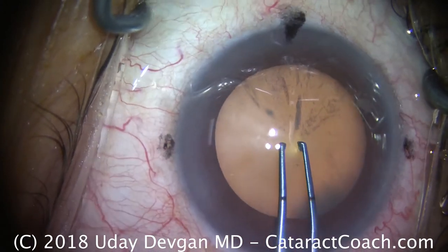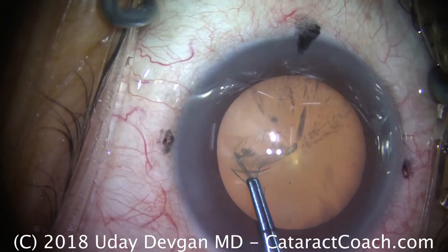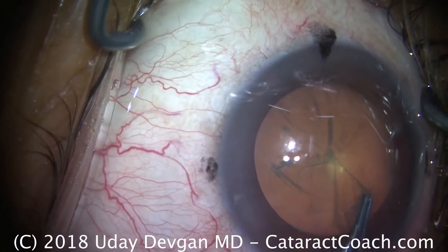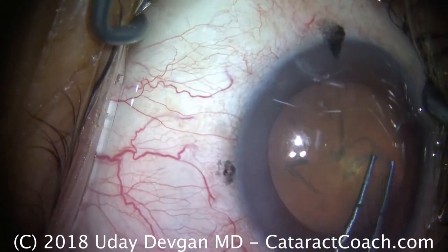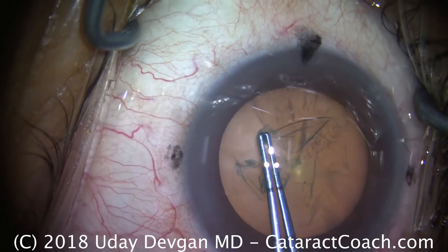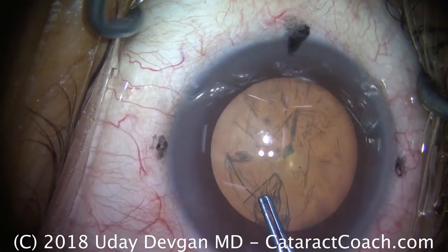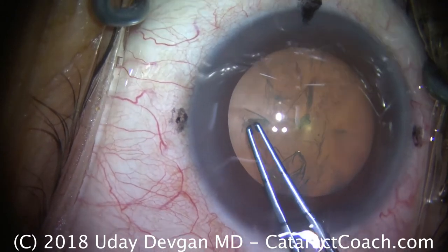Forceps are going in the eye to make our capsulorrhexis. We're creating a nice, round, continuous capsulorrhexis in the anterior lens capsule. We want to make it sufficiently large — aim for about a 5.5mm capsulorrhexis. Keep in mind that it will shrink-wrap down, so if you start off with 5.5mm it'll probably shrink-wrap down to about 5.0mm after a couple weeks of healing. There's a nice, round capsulorrhexis — that looks great.